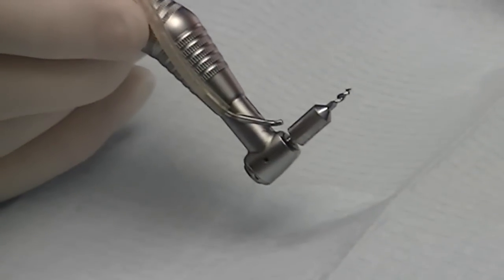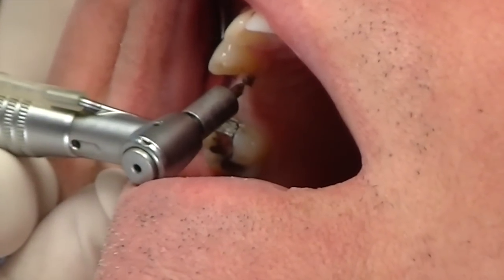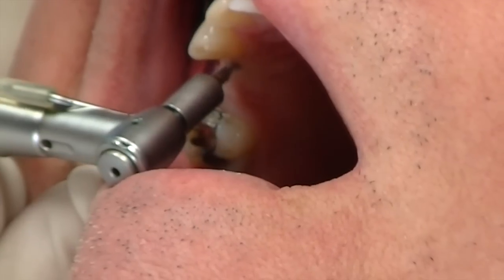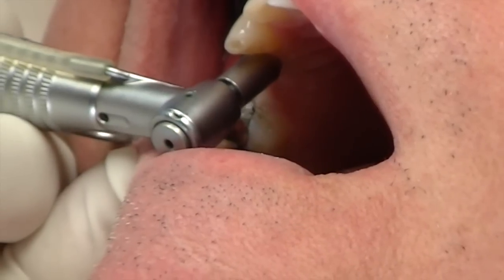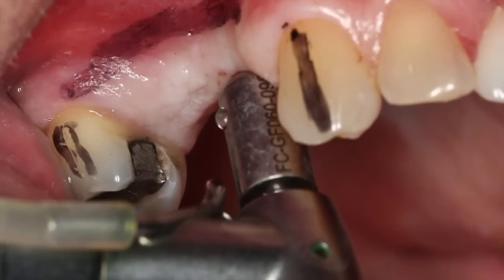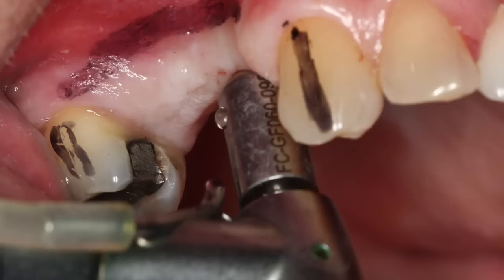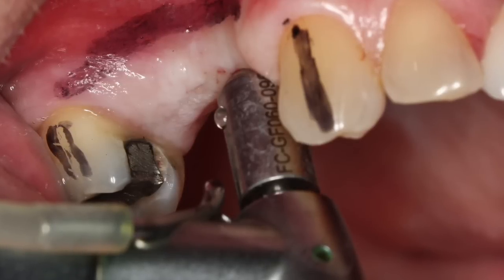Another wonderful tool that I use to make my implant surgery a little easier is something called the MD Guide — mesial distal guide. We purchased these from Golden Dental Solutions here in the Detroit area. It comes in a kit and you can see it has a pilot drill at the end, and a round cylinder which duplicates the mesial distal width of the tooth you want to replace.